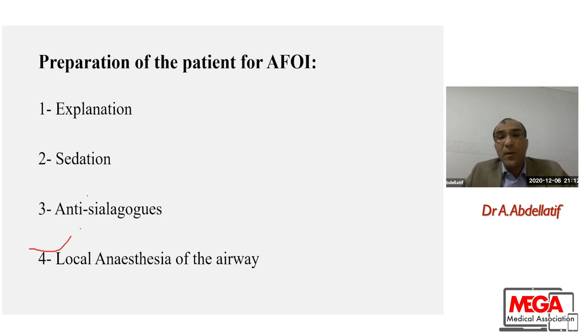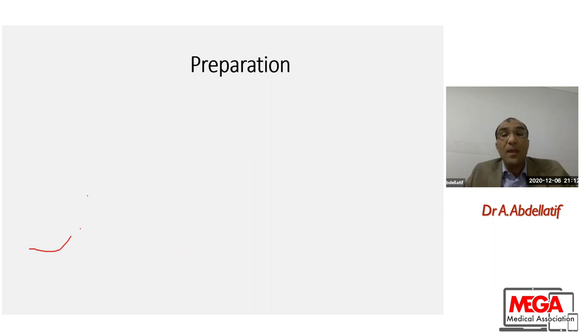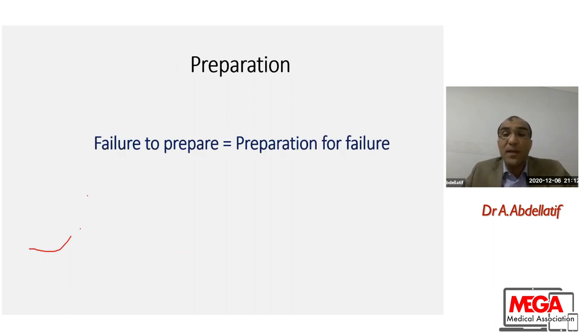Preparation is very important for a patient for awake fiberoptic intubation. Preparation in four steps: explanation for the patient, sedation, anti-sialogogue, and how to do local anesthesia of the airway. I 100% believe in this statement: failure to prepare is a preparation for failure.